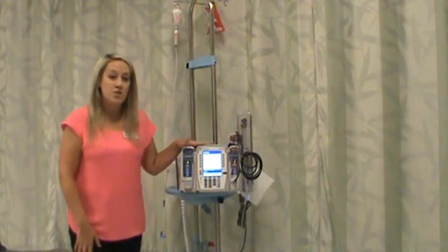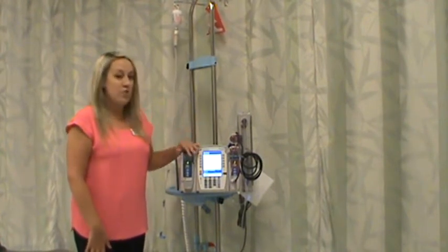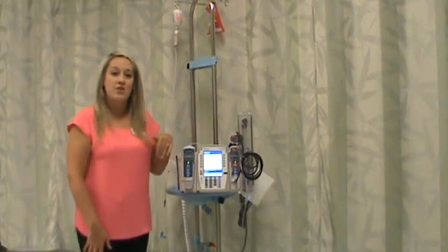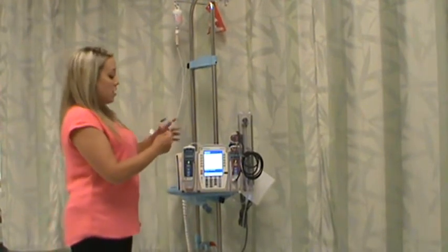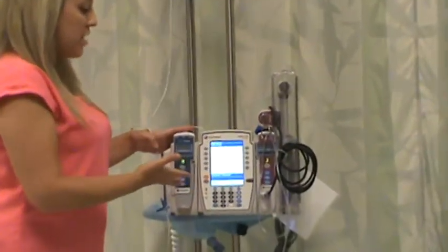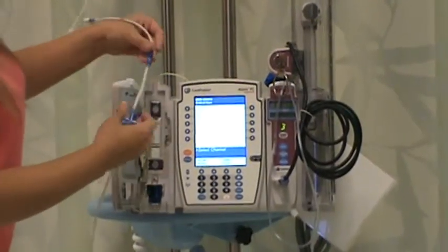For your actual simulation, your pump will already be primed and loaded and running. But I want to walk you through how to load that and how to program in a medication to it just really briefly. And then we'll talk about what you need to be focused on for your actual simulation. So first of all, of course, we'll have our medication primed here. And you'll find that this pump, even though it's a lot bigger than the Baxter pumps, is very similar in how you'll program it. You'll just open up the door here.